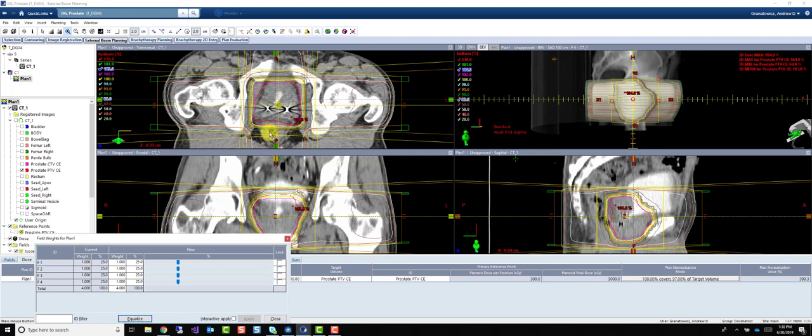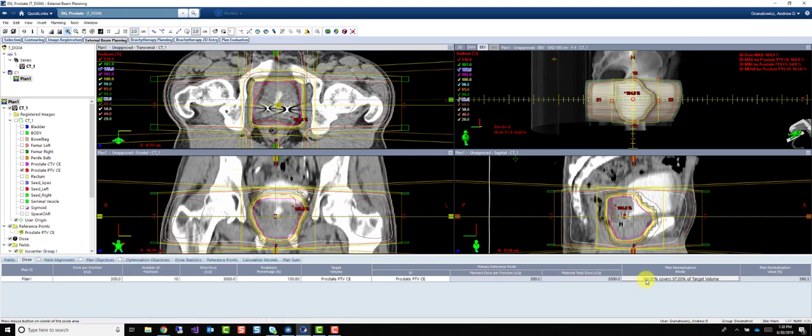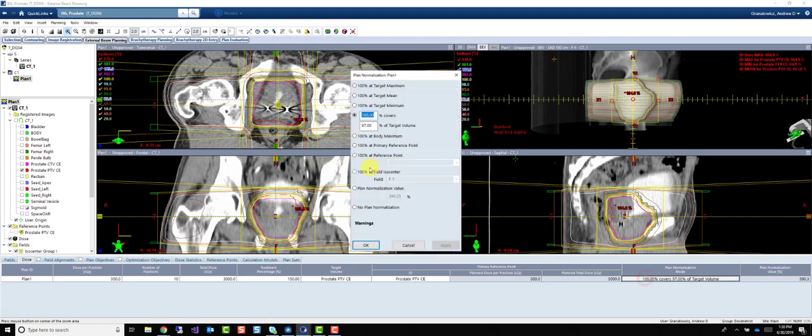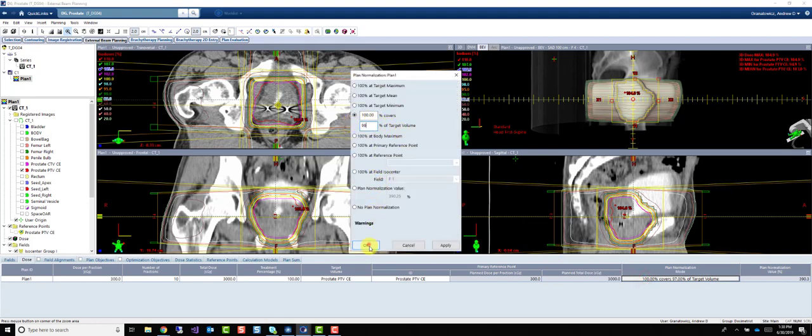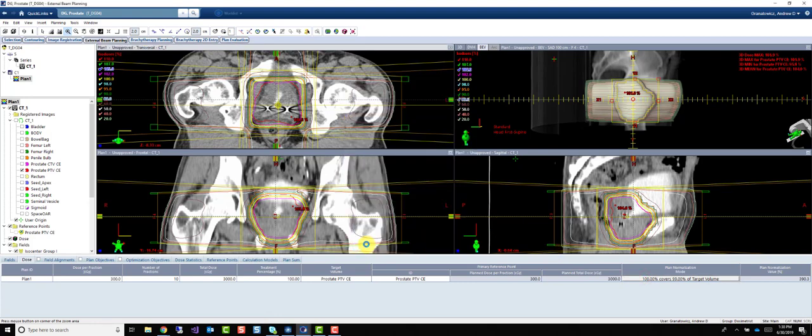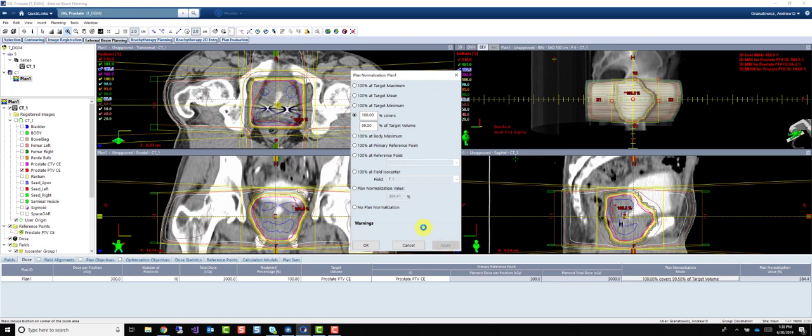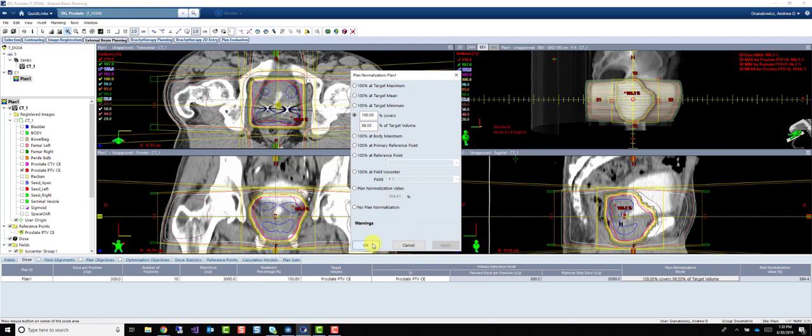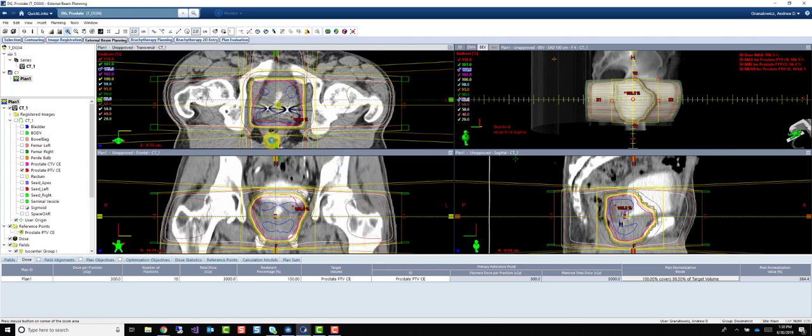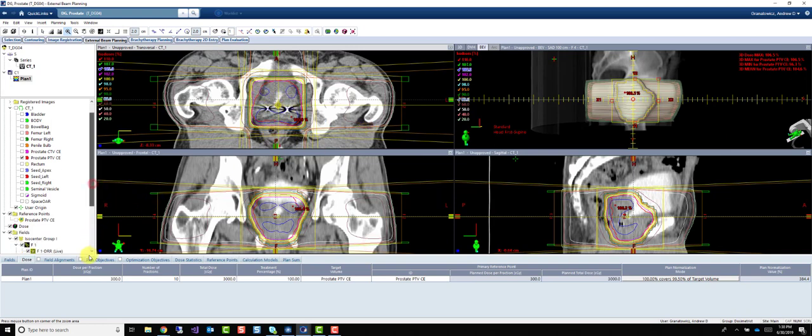What I want to do, though, is see just how good a coverage we can get. So even at 99.5% coverage, our max dose is 106.5. So what that tells me is that we can probably decrease our margins.